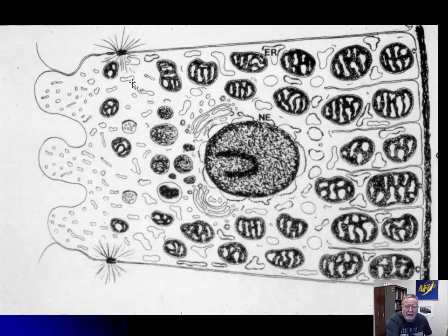Another major change that you're seeing here in the late stages of reversible change is the loss of the surface substructure. That cilium, boop, it's gone. I'm not sure, the basal body is probably floating around somewhere, lost and depressed because the cilium's gone, but it's just gone. And remember all those microvilli?